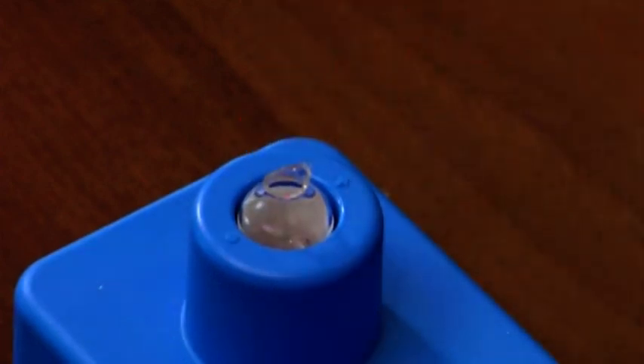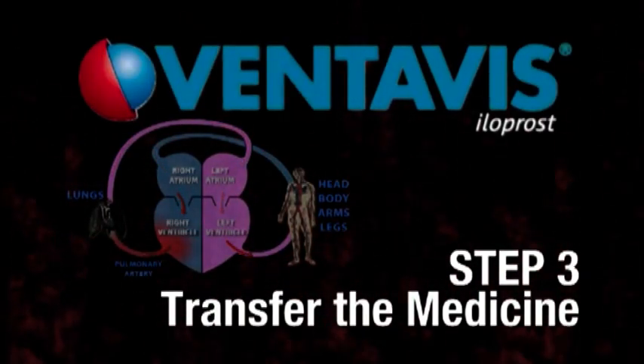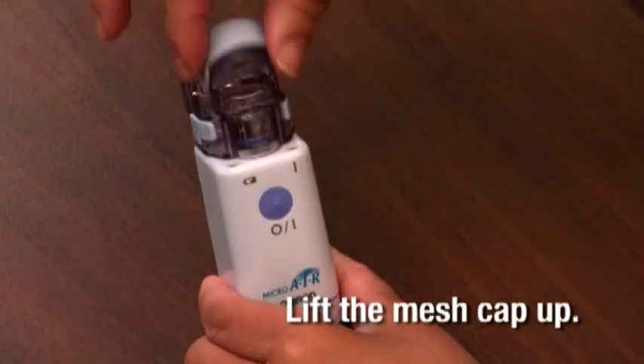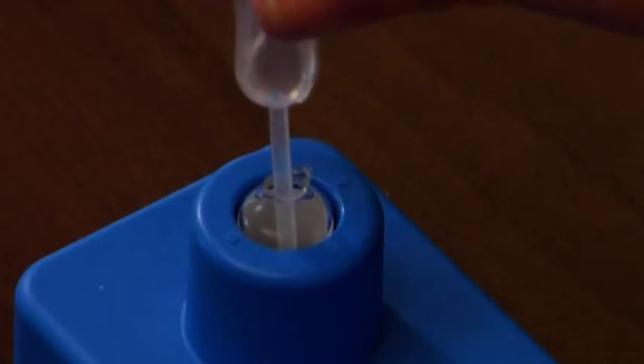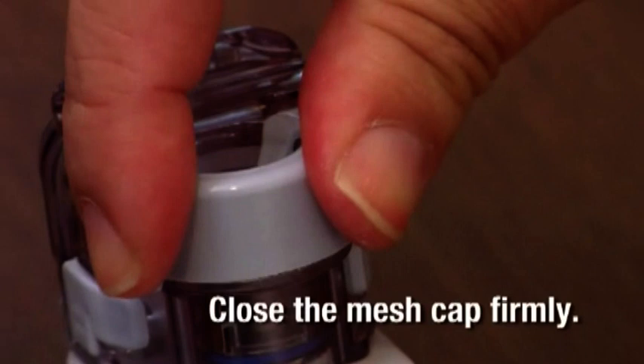You are now ready to transfer the Ventavis solution into the nebulizer. The medicine chamber in the nebulizer lies below the mesh cap. Lift the mesh cap up. With a clean pipette, pump in the medicine and transfer it into the medicine chamber. Close the chamber by lowering the mesh cap and closing it firmly — if the mesh cap is not securely closed, the solution may leak.